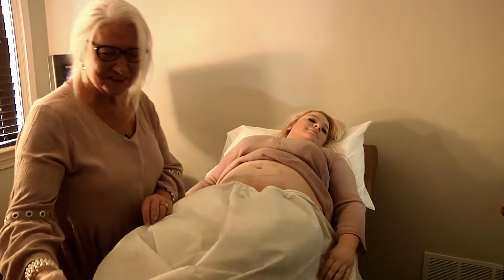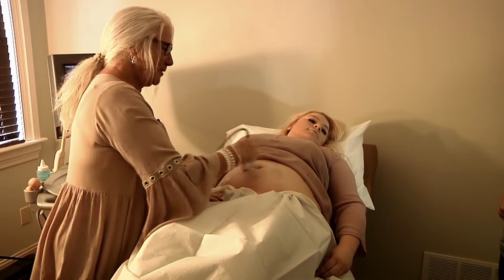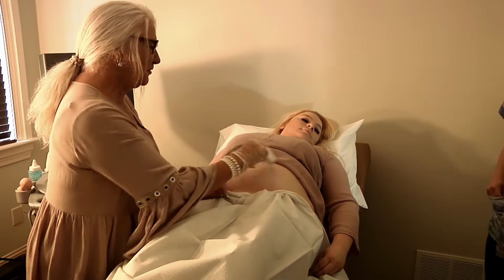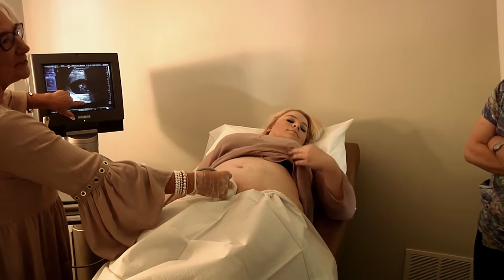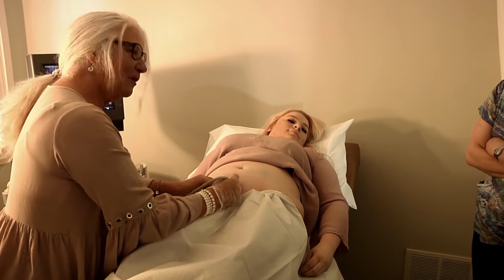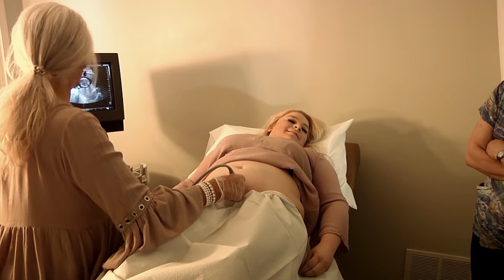Okay, so Melanie's back in room. She's emptied her bladder. She's smiling. She's comfortable. So once again, we're going to start with the sagittal, spread the goop around, and we always want to make sure when you scan the lower uterine segment, you've got to get underneath the sheet. If you don't get underneath the sheet, you get this big black mark right here. When you see that, it's because you're either on her clothes or on the sheet. So get underneath the sheet. Oh, much better. She's emptied her bladder.